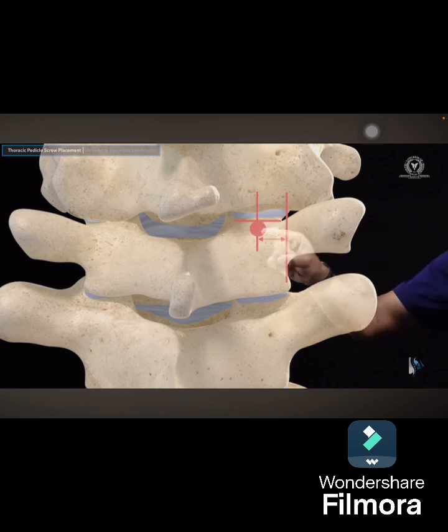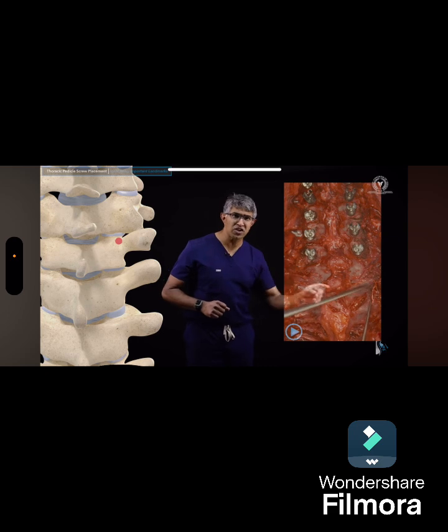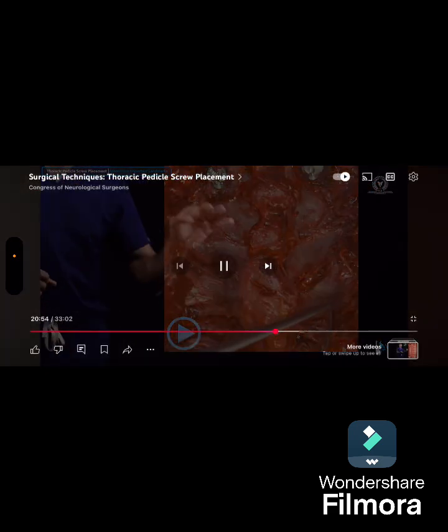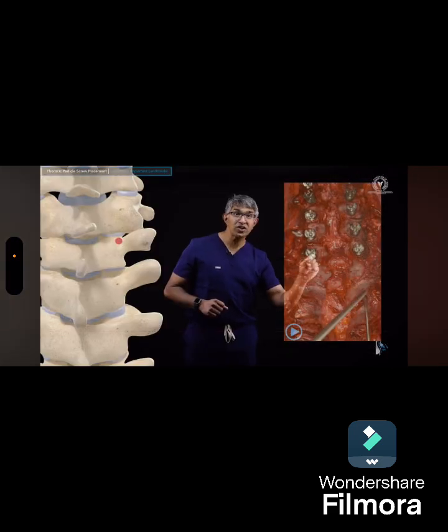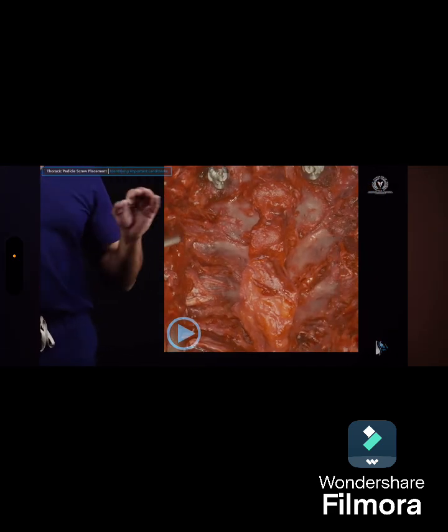I always put it at the ridge, which you can't necessarily see so well on this. You can see it kind of down at T1 and here's T2. So let's look at the landmarks themselves. You can see here with pen 4, you can identify the lateral border of the pars of T1 and again T2. This is looking at the width of the joint here, so you can see the full width of the joint. Midpoint is about here, and there is the range of where you could put your screw in from a medial to lateral perspective.